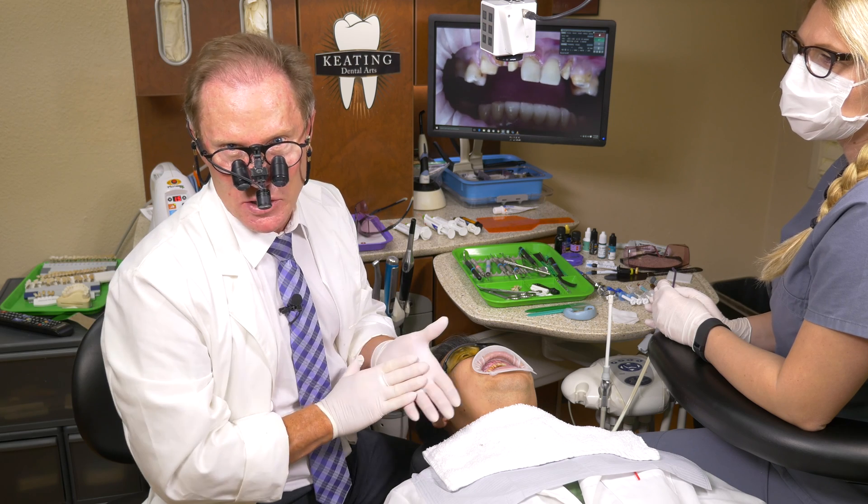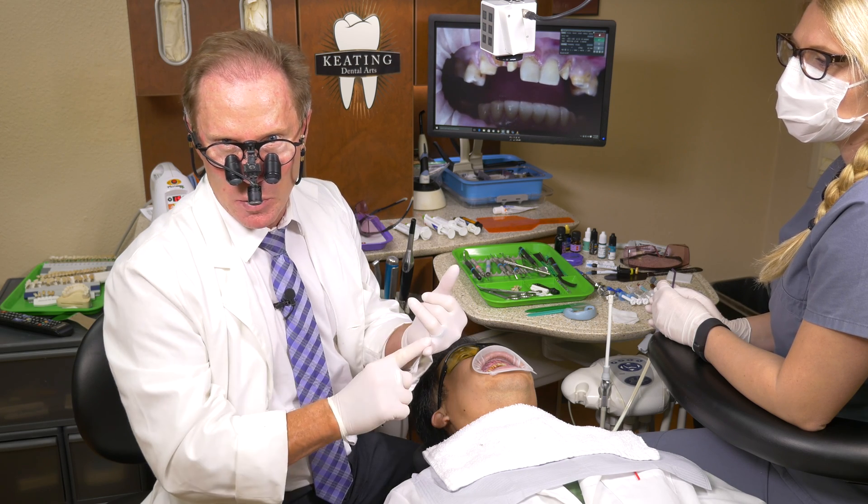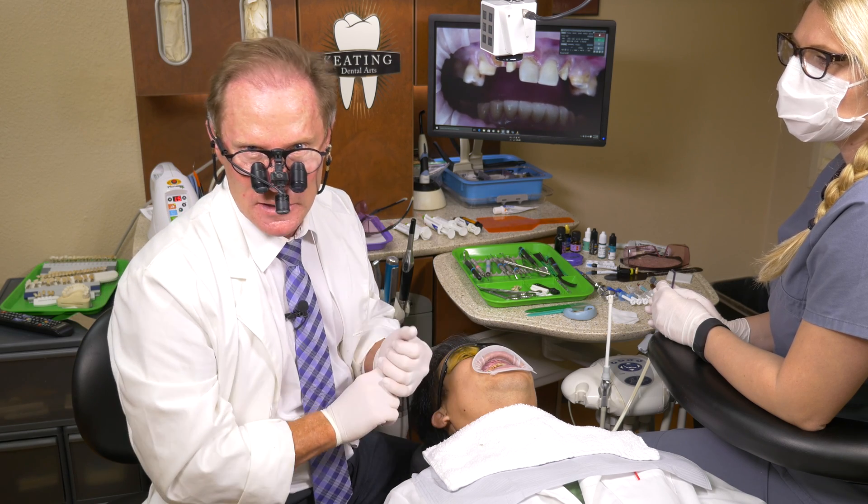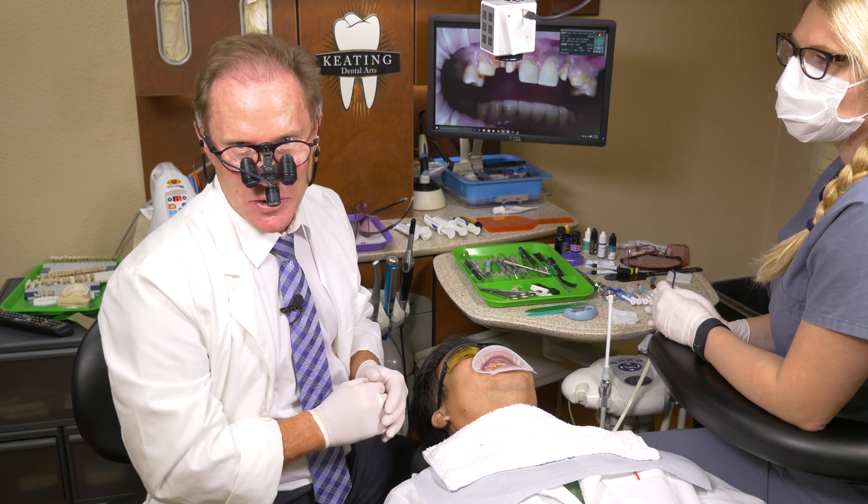Again, the AMD Laser Picasso Light is excellent for this — stable, no postoperative discomfort, very fast. Hope you enjoyed this episode on ovate pontics.